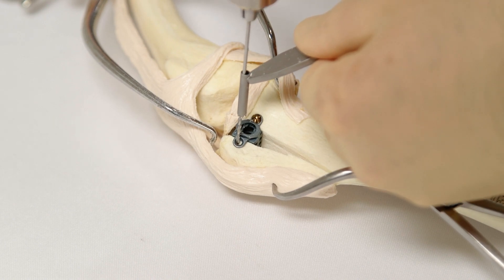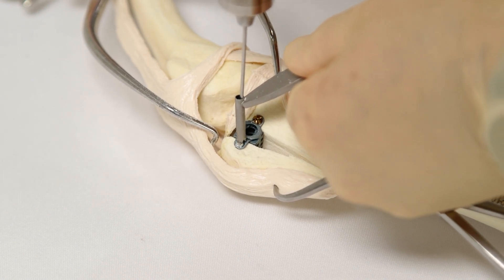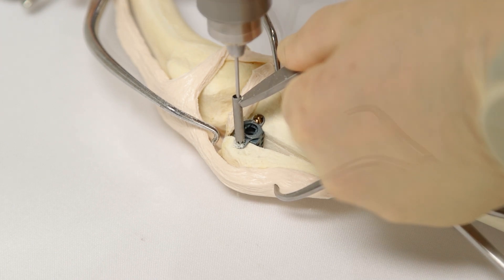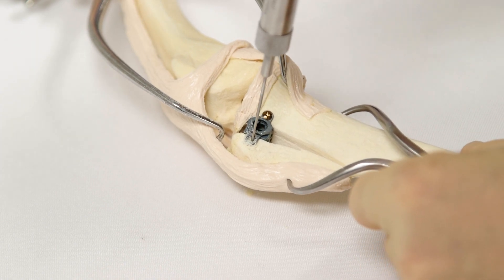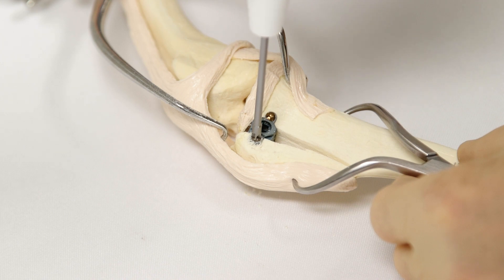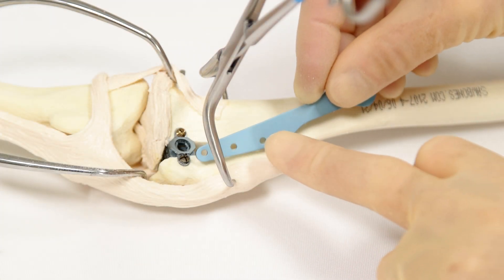Now drill the pilot hole for the cranial cage screw using a 1.8 mm drill bit and drill guide. Aim for where there is most bone stock, usually slightly cranial and slightly distal. Ensure that the head of the screw engages the cage ear correctly.